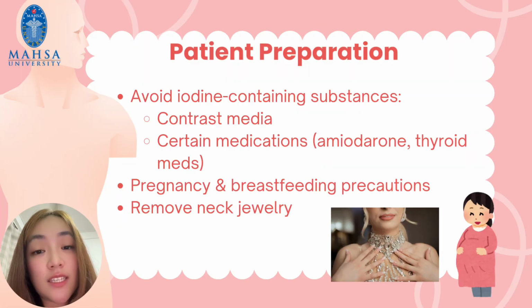So the next one is patient preparation in the thyroid scan. The patient must avoid any iodine-containing substances such as contrast media and certain medications like amiodarone or thyroid medication. And we have to remind the patient also about the pregnancy and breastfeeding precautions, and remove any neck jewelry.